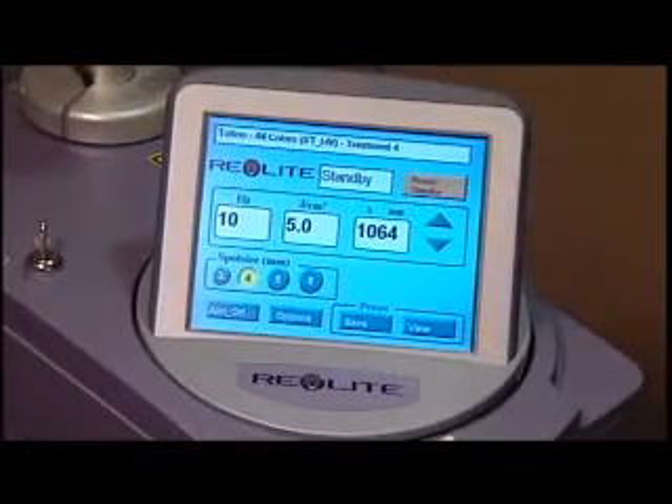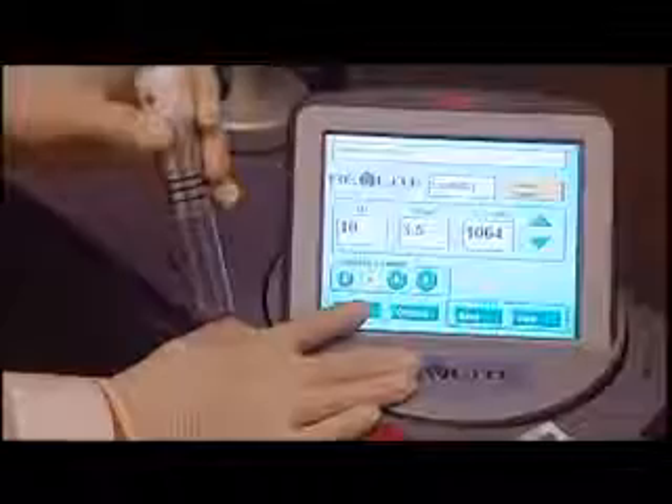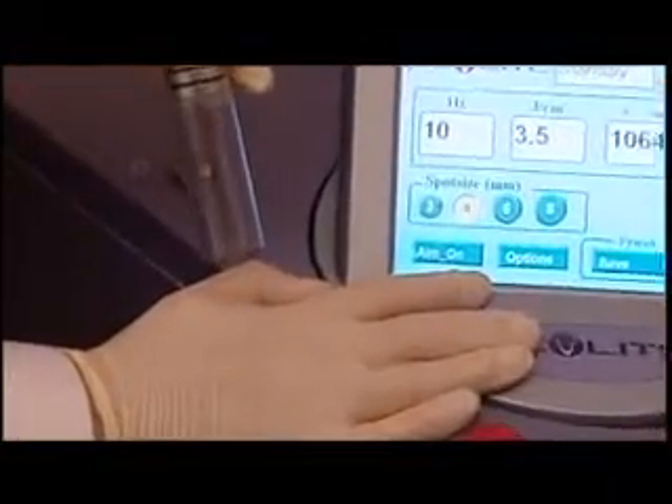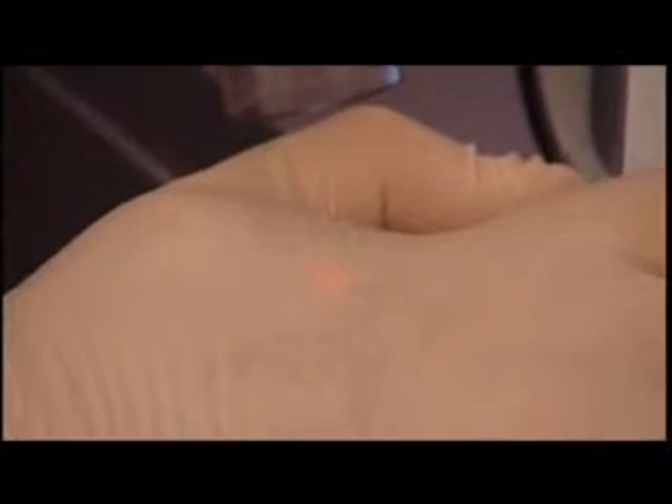The Revlite system is not only safe, effective, and simple to use for both beginner and advanced laser physicians, but it has an aiming beam that makes it virtually impossible not to see where you're treating. With many systems, you put your laser goggles on and you can't find the laser beam. This is a simple system — you know where you are, and it's easy to use.